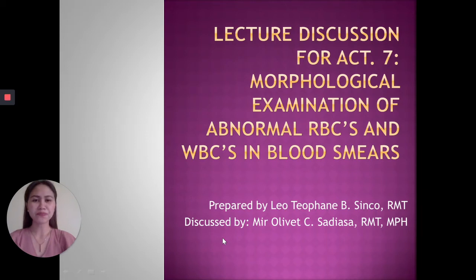Greetings everyone. This video is for Activity 7, the morphological examination of abnormal RBCs and WBCs in blood smear. Like your Activity 6, you should also draw abnormal RBCs and abnormal WBCs using your worksheets. After you draw the abnormal RBCs and WBCs, you should scan your worksheet and submit it virtually to your instructor. So let's start with our lecture discussion.